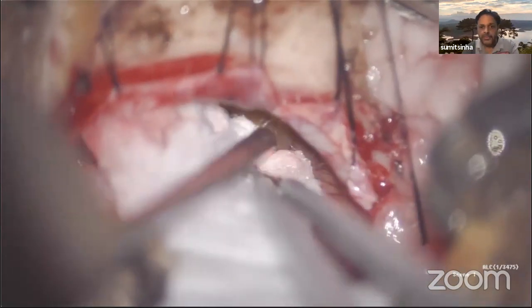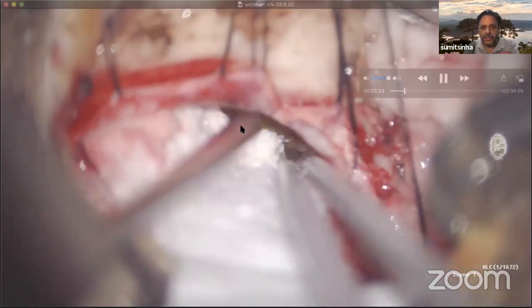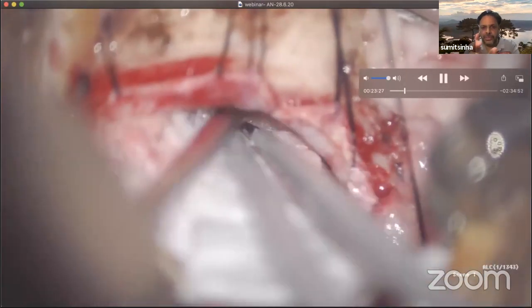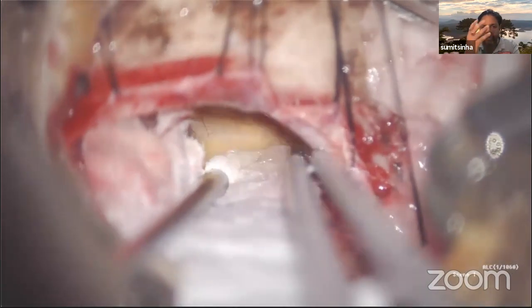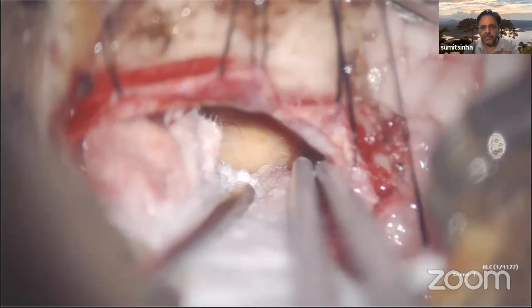So there is the cyst that I was talking about in the MRI. You see that? This is the cyst over there, sitting right there, and this made my day. I mean, this is the thing which you want to see as an acoustic neuroma surgeon. If you're greeted by a CSF cystic space, initially your day is made. I mean, this is wonderful.